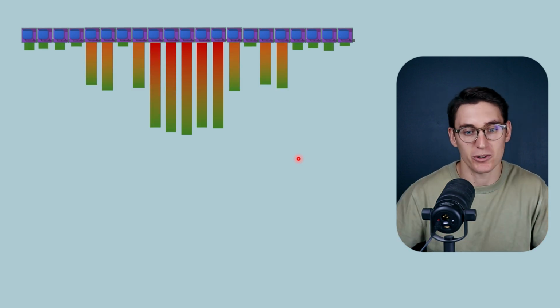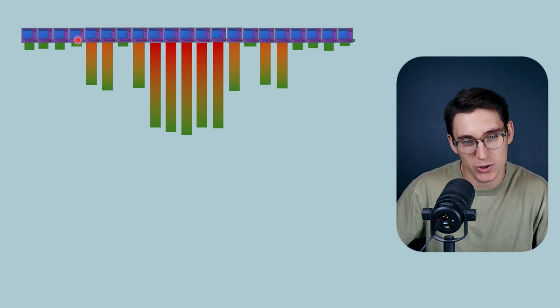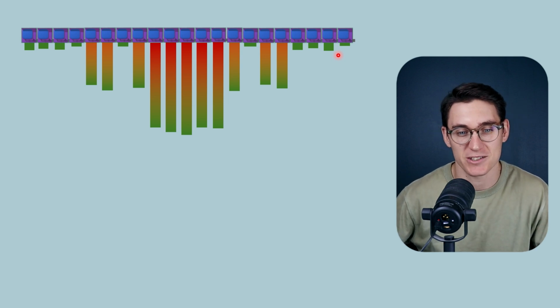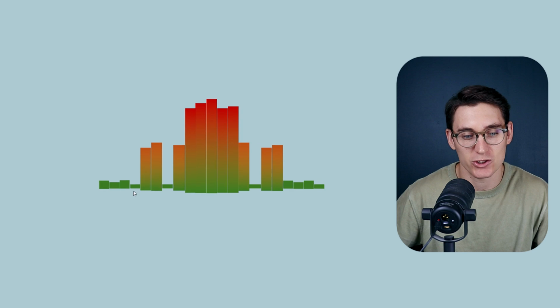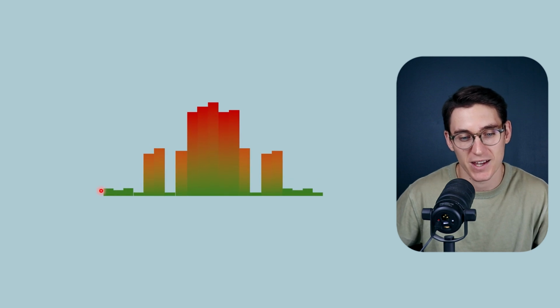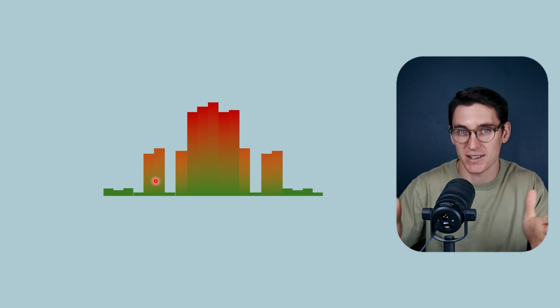When we read out an entire row, you saw that the ASIC actually runs in between each one of these detectors. When we flip the transistor switch, we can actually read out an entire row of detectors. We're going to get a graph representing the electrical stored energy in the capacitors. And that differs depending on the detector location because of the differing anatomy that the X-rays have traveled through. We can then convert the stored electrical energy into our sinogram.